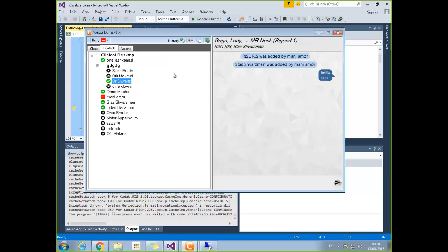No. It is just a database table at the end of the day. Two database tables actually. There's an instant message table that holds the message, and then there's an instant message recipients table. So for every message there can be one or more recipients. So you have to coordinate the cleanup, but it's certainly possible. You just have to be careful: how much do they want cleaned up, and when do they want it cleaned up? Messages start disappearing. Hopefully there will be a configuration.